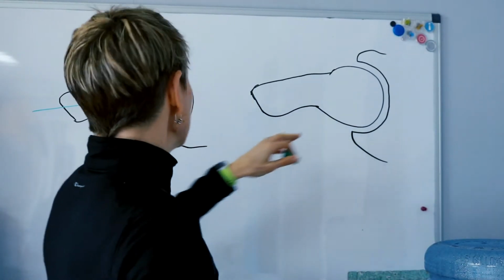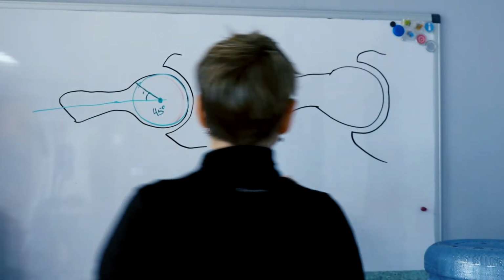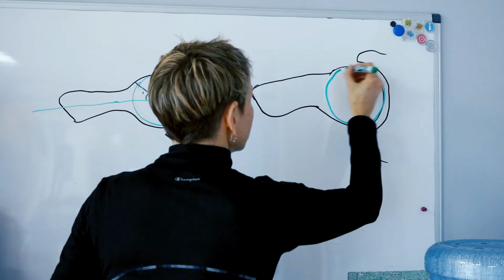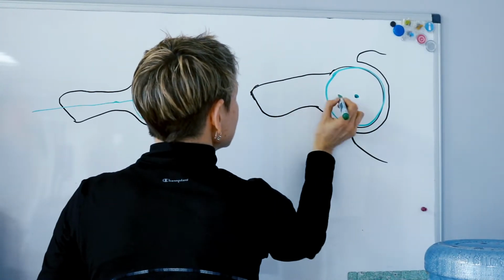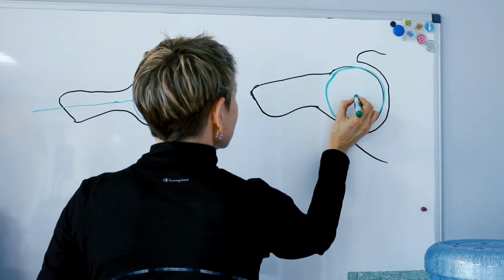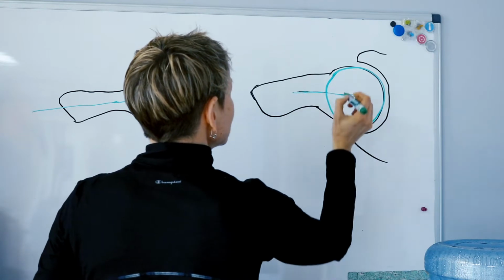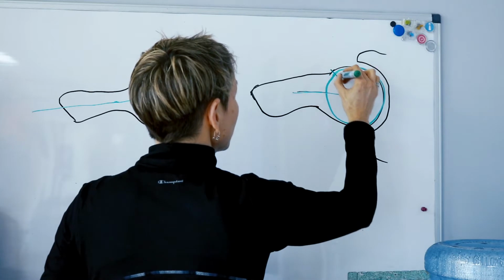So let's look at this one. So this would be below the impingement threshold. If we look at this one, again, let me try to draw that circular, and we'll find the middle of that. And then the center of the narrowest point of this femoral neck. So let's say it's there. So this would be the one axis. But then where does this deviate from the circle? Well, it's sort of more up here.